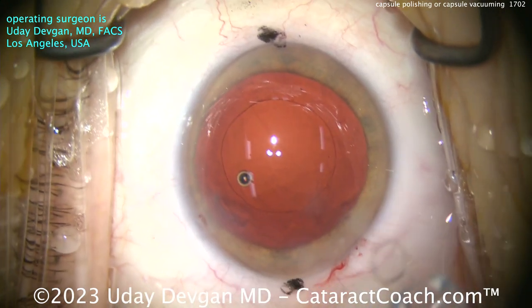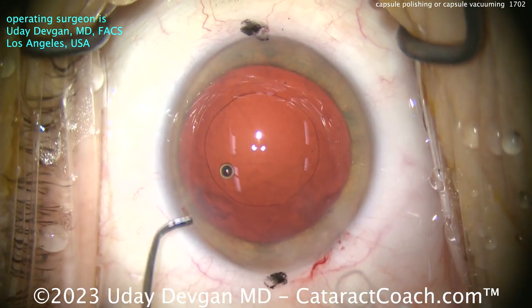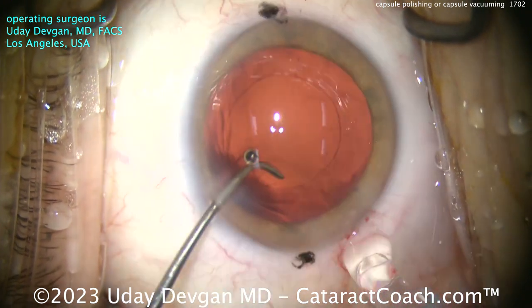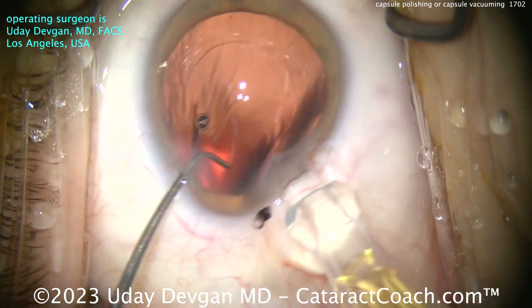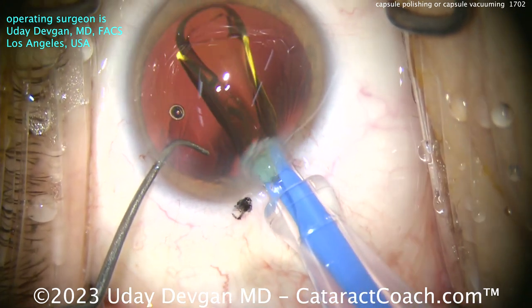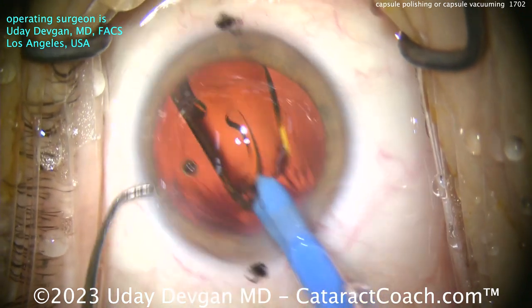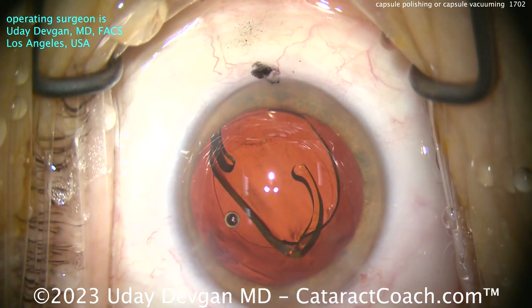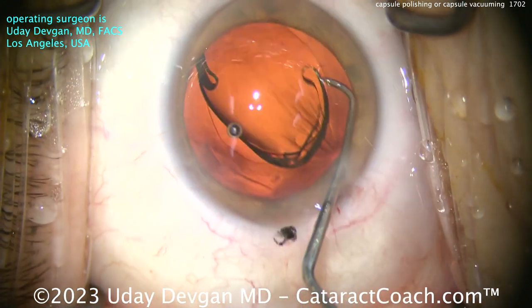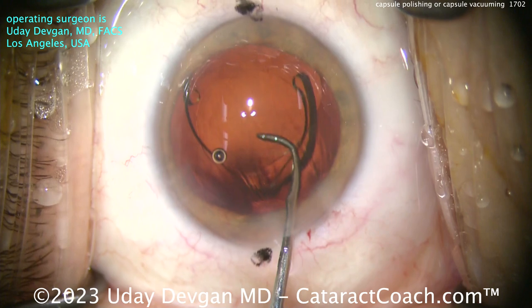But at the end here, watch — I'll put the IOL in the capsular bag, and then I'm going to go in with the IA probe and clean up a little bit more. There's more lens material or cellular debris that we're going to clean up from that undersurface of the anterior capsular rim. I think the IA probe with a low level of vacuum is probably better than just a mechanical way of scraping it with friction.